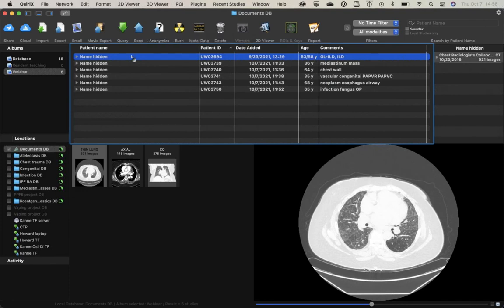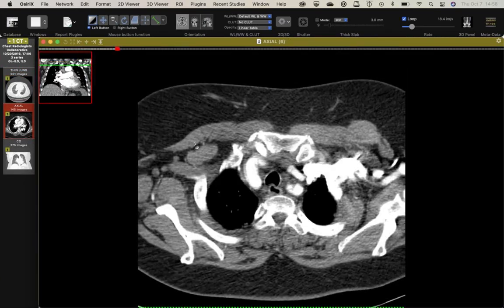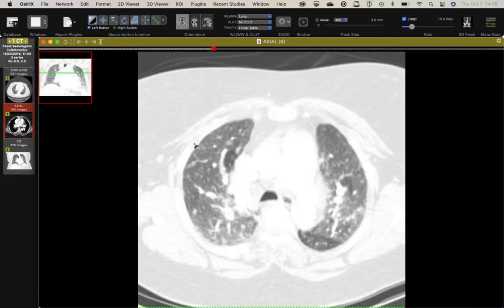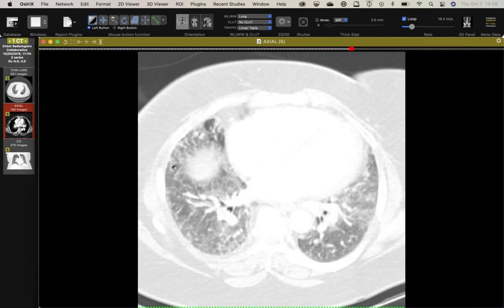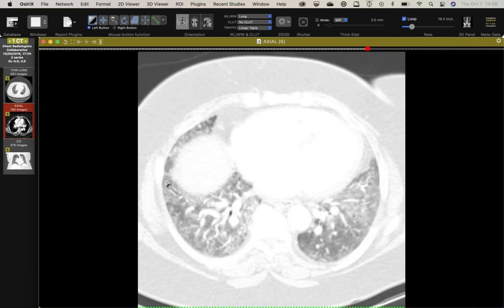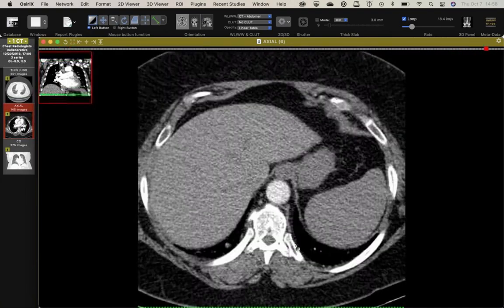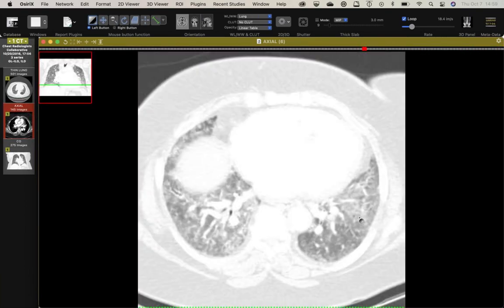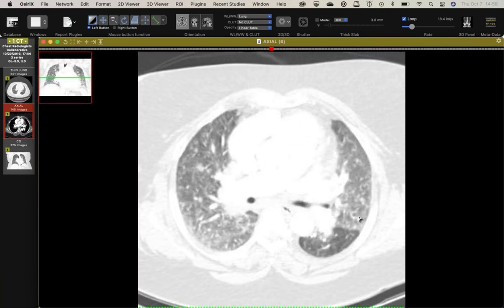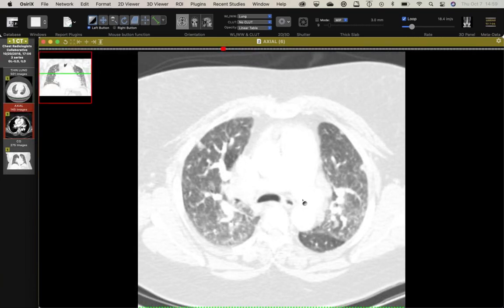This is something I had not seen before. This is a patient with common variable immunodeficiency who years ago had a CT. It's expiratory, not a great scan, but you can see a background of all these nodules, and a big-ish spleen. It looks a little rounded, a little full. So in this context of not being acutely ill, and there's pulmonary hypertension too, a presumptive diagnosis of what they call granulomatous lymphocytic interstitial lung disease.